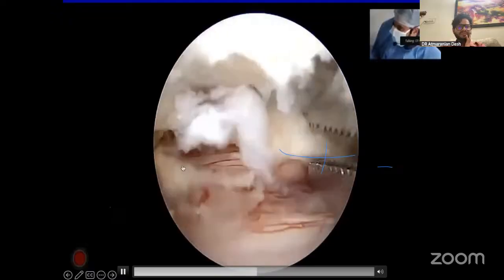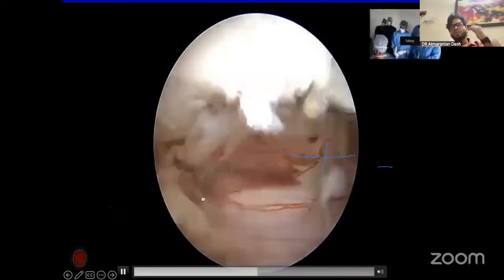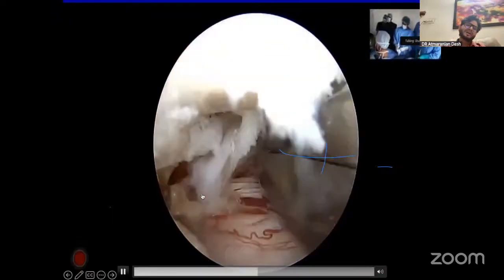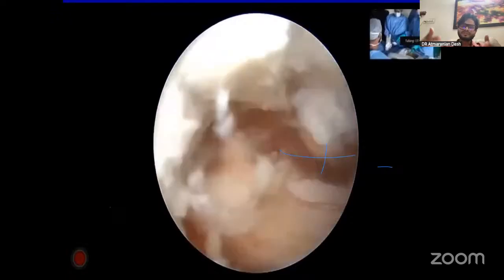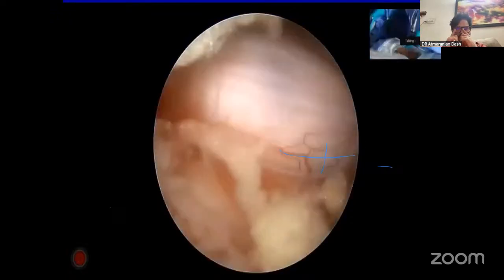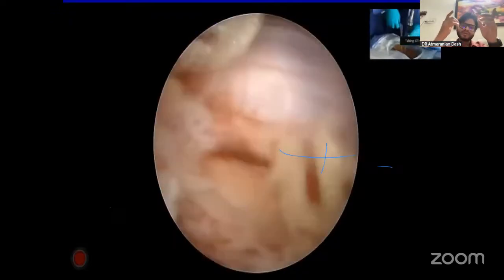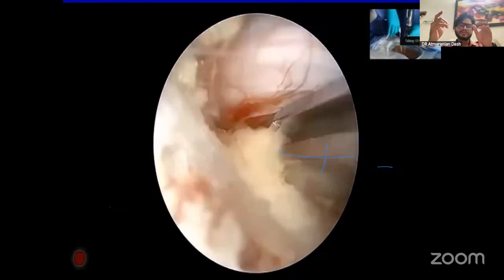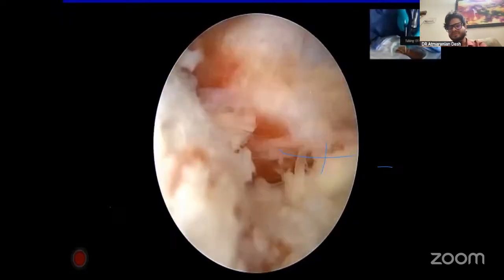This is like an exploratory surgery most of the time. In biportal, we say this is an open surgery inside, but still ultra minimally invasive, because the scope gives us the advantage of corners, like we do in endoscopic pituitary surgery. You can put the scope inside and see all those corners and the arachnoid bulge. Similarly, in biportal endoscopy, the same thing can be done, which was not possible with microscopy.